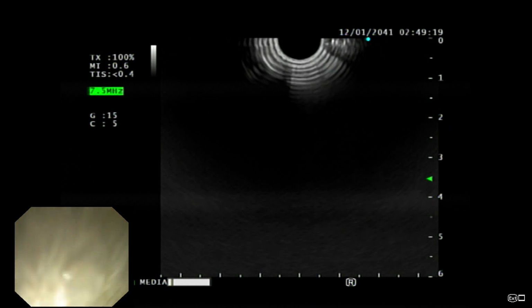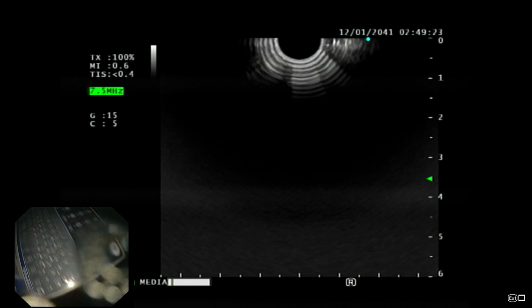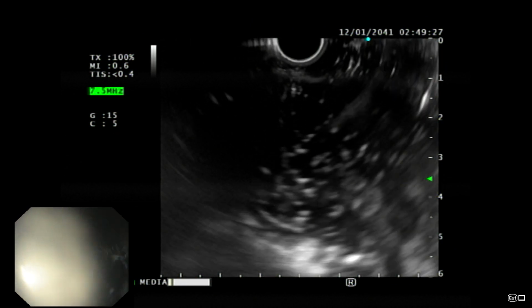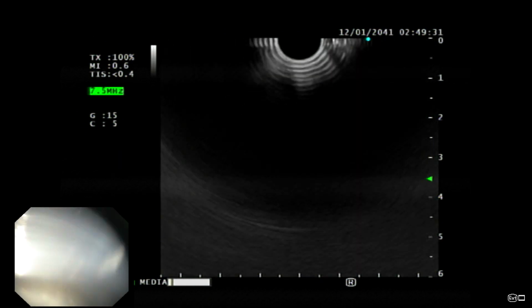But if it doesn't, then I think close follow-up would be important, just to make sure we're not fooling ourselves into thinking that it's something benign. Yep. And then consider sampling. Exactly. That is very important. Like, we need a close follow-up. अगर कोई change हो imaging के ऊपर, तो then we need to do FNA of that.